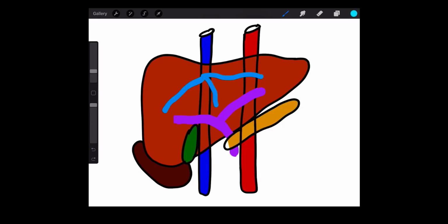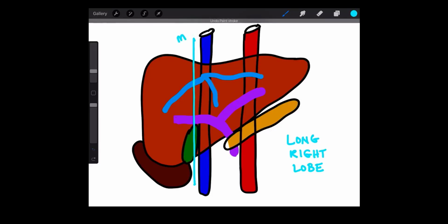We'll then want to increase our depth so we are able to visualize all of the long right lobe as it's much larger than the left lobe. We may need to change our focal points, change our frequencies, or penetration of our machine settings. We're going to start with a long right lobe medial picture that is going to cut through the right portal vein and the gallbladder.